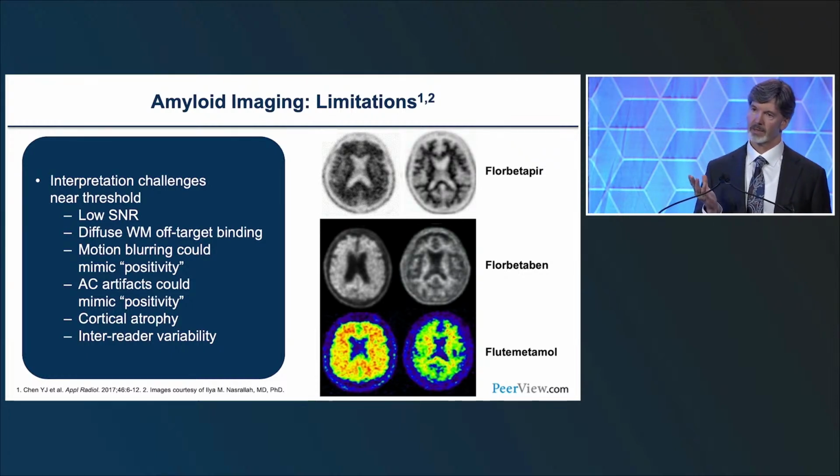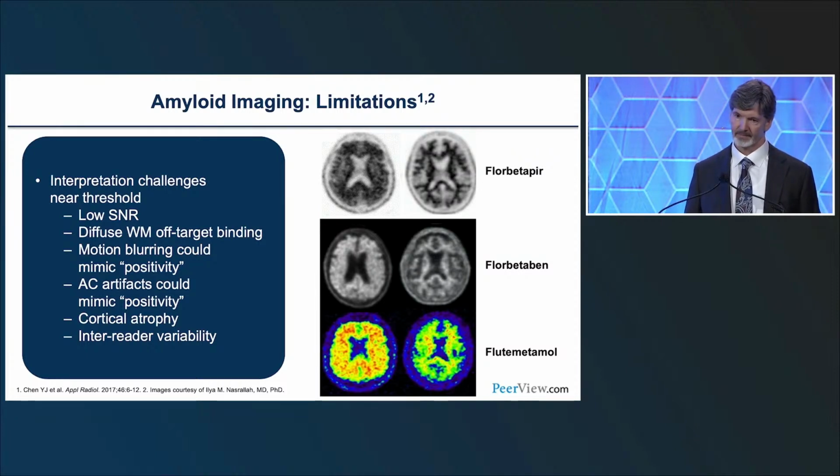How do you tell motion on a PET scan? Look for the scalp line, see if there's two, see if somehow that line's been blurred as well. That should always be pretty much a thin line. So if you look in these scans here, for example, right here, you always want to see this thin line out here, right? Don't accept it, or raise some caution, if there's two or if it's blurred, all right? Also look for asymmetric tracer, one side being brighter than the other.